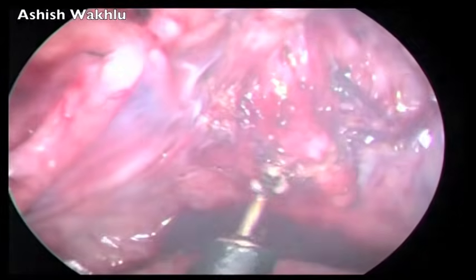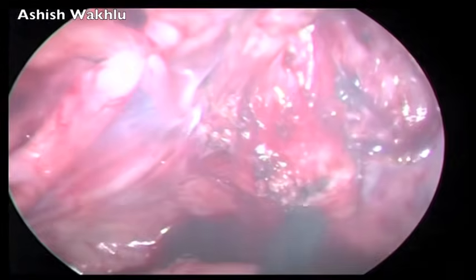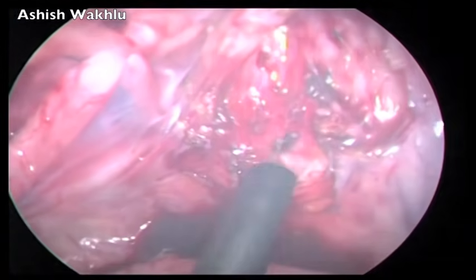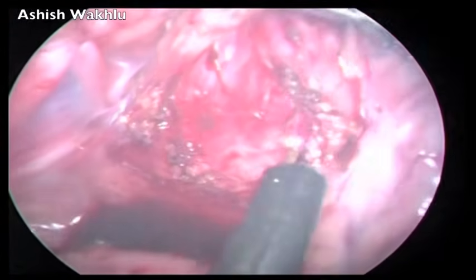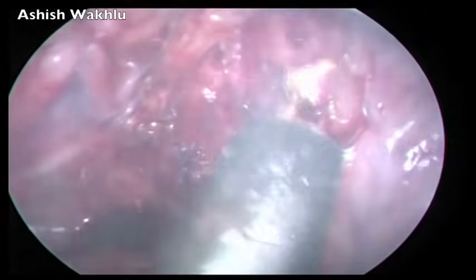In this sort of situation, there isn't any faster way of doing this other than to cautiously dissect your way through, go by the feel, and wait for the correct planes to open up.